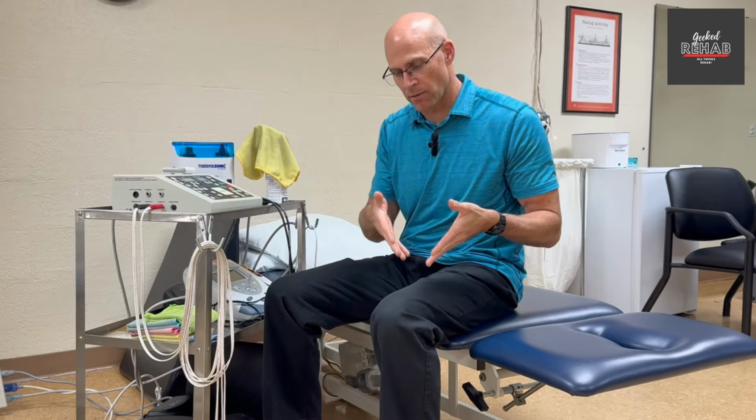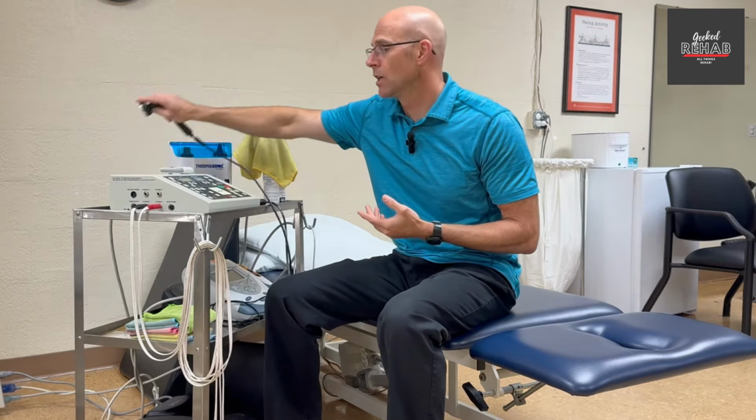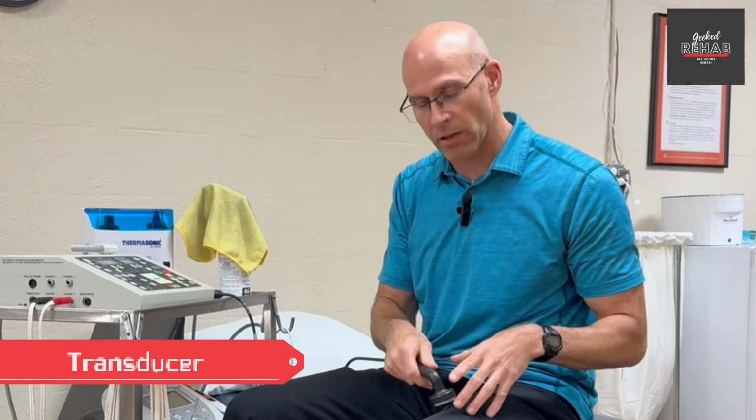It works in a similar way as a regular ultrasound for visualizing images, but this doesn't bounce back or refract off the tissues and come back onto the transducer here. That's the transducer to create an image. This goes down and it's absorbed into the tissues. So if you go into therapy and they want to do an ultrasound on you, don't expect any pictures.